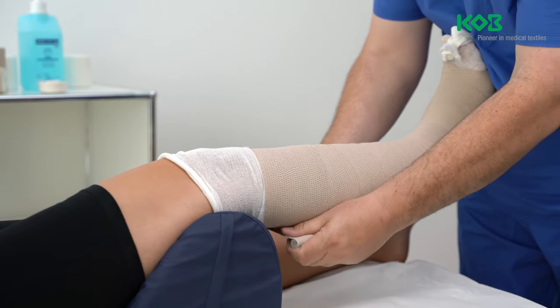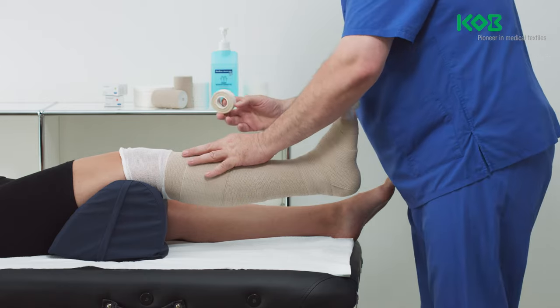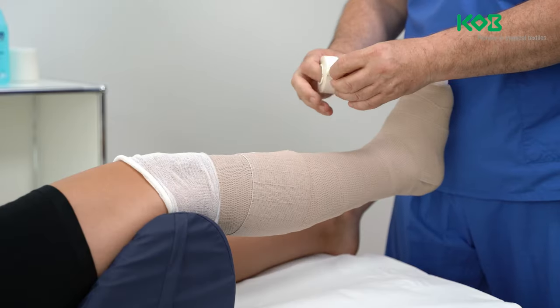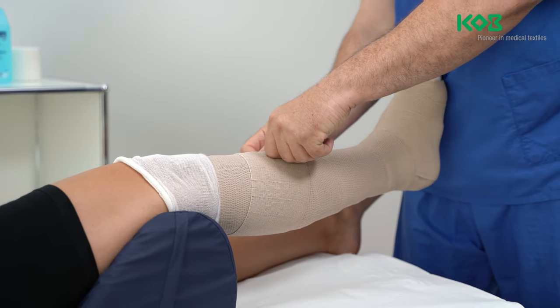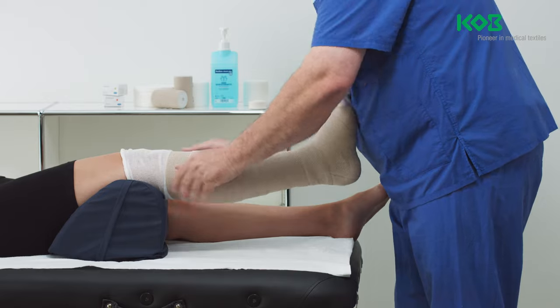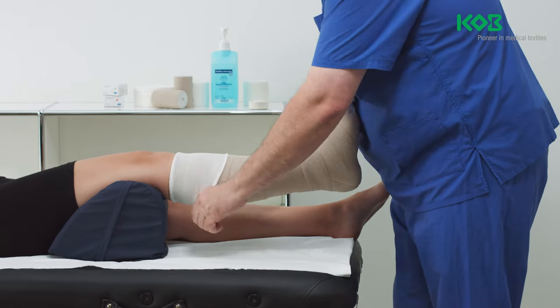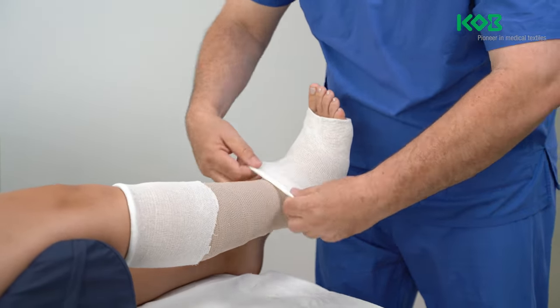Starting at the middle of the calf where the lower leg tapers again below the knee, moderately reduce the extension of the long stretch bandage to under 50% of its capacity. Secure the end of the bandage with adhesive strips. Pull the tubular bandage located above the patella and beyond the toes back over the compression bandage. The patella and toes should now be visible.